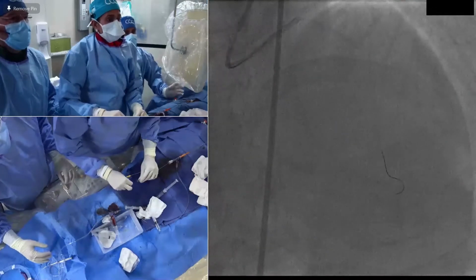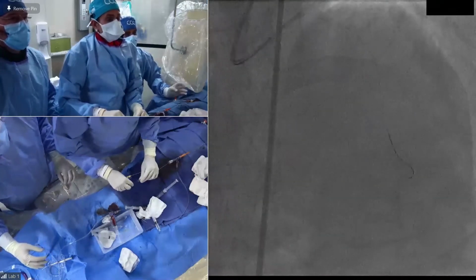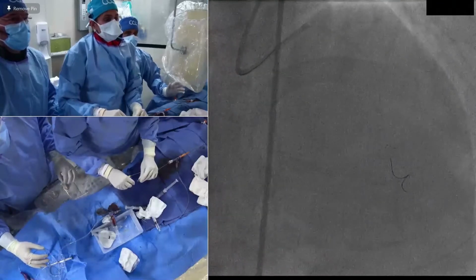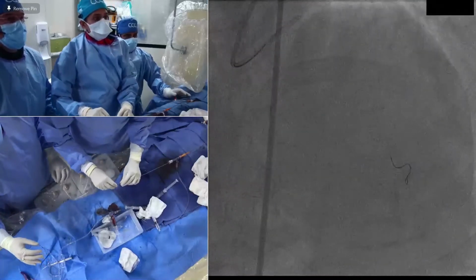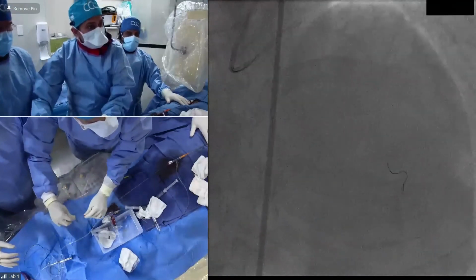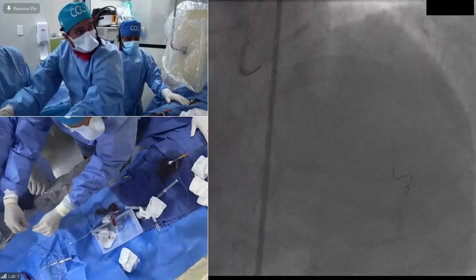That's good. So at the risk again, as Antonio brought up, of driving up the expenses, this is actually a good spot for a dual lumen catheter, so you don't have to traverse that dissected plane a second time. I know that we're going to. We already had the Fine Cross to use in the beginning, so you just use the same catheter.